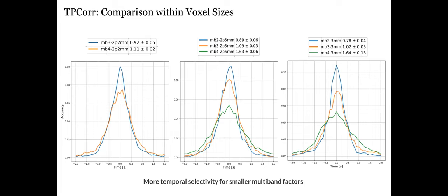In general, it might be interesting to look and see if slice timing correction as a pre-processing step is contributing to this at all, because when we're looking at such a small time frame, it really does matter when we are collecting these different slices along the z-axis.